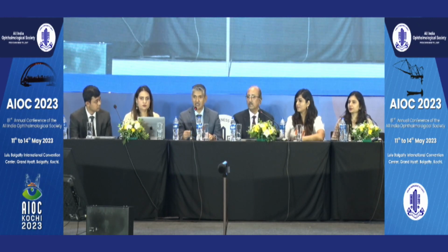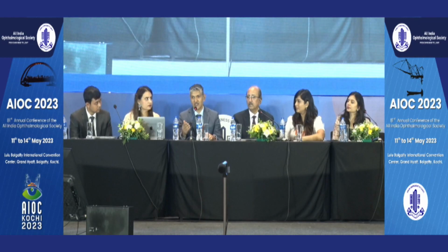But sometimes, in cases like AcrySof lenses, you may not be able to. If it's a long-standing case, then you may not be able to remove the haptic, in which case you can leave it behind. There is no problem. When you put in the second lens, see that the haptics are positioned 90 degrees to this haptic, in the area where you have opened the bag, and it should center quite well.